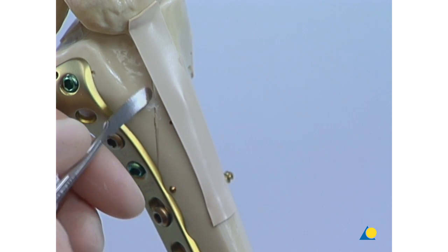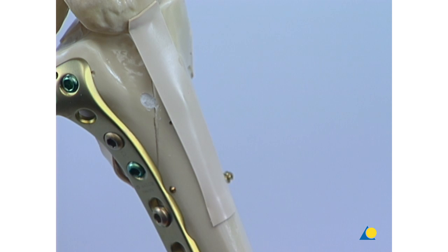Finally, excess Kronos inject material is removed from the bone surface.